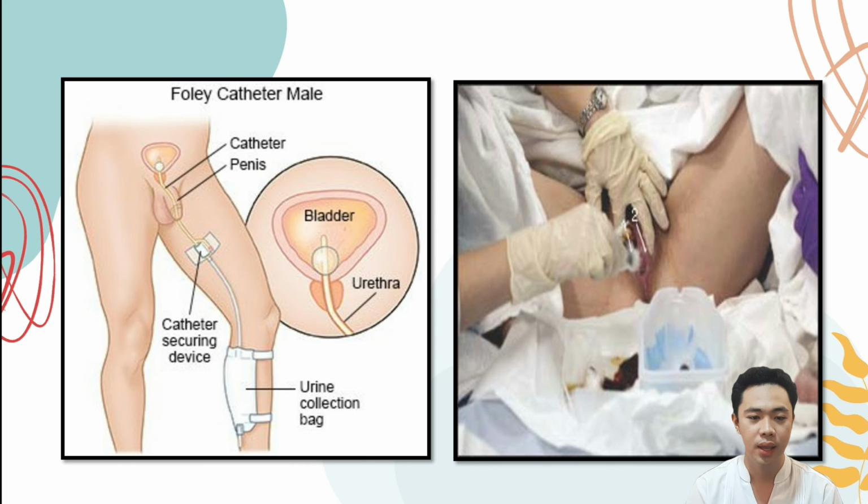Attach the prefilled syringe to an indwelling catheter inflation hub. Apply agency policy regarding pretesting the balloon. Lubricate the catheter 2.5 to 5 centimeters or 1 to 2 inches for females and 15 to 17.5 centimeters or 6 to 7 inches for males and place it within the drainage and inside the collection container. If desired, place the fenestrated drape over the perineum, exposing the urinary meatus.